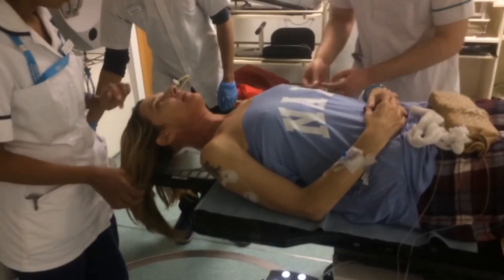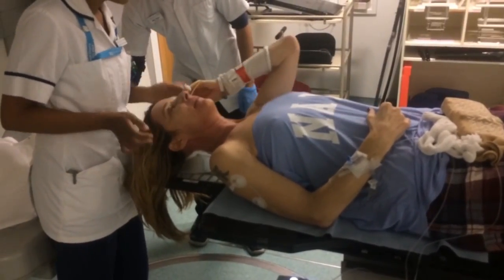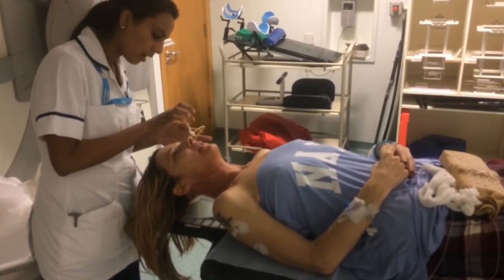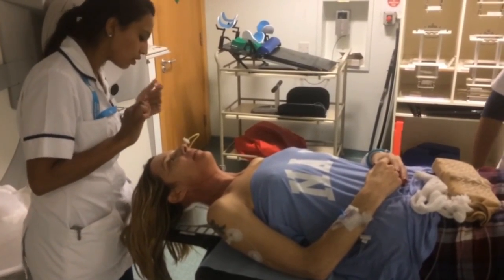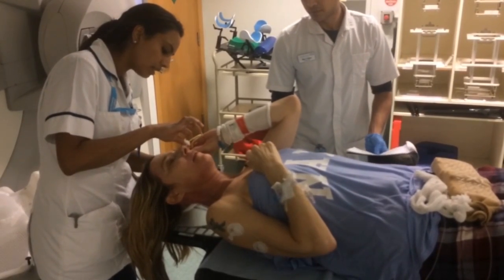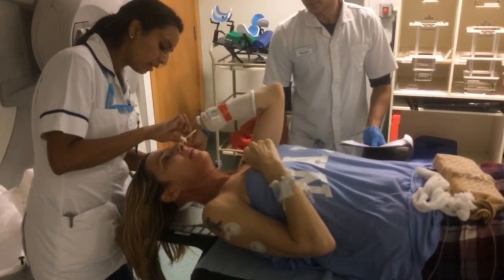So, what I might need to do is actually take this tape off, because it's sort of swinging up a little bit, it's not flush against your face. Yeah. We don't want it to be sort of pulled out once I put your mask on. Yeah. So if you take it off a little bit for me, and then.